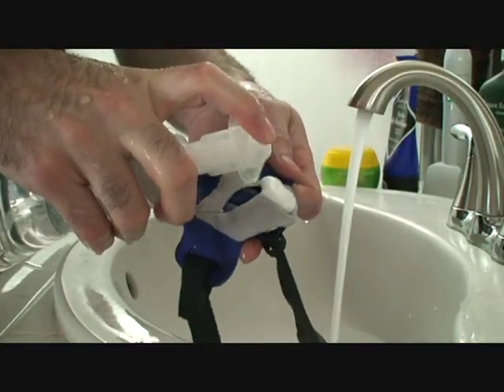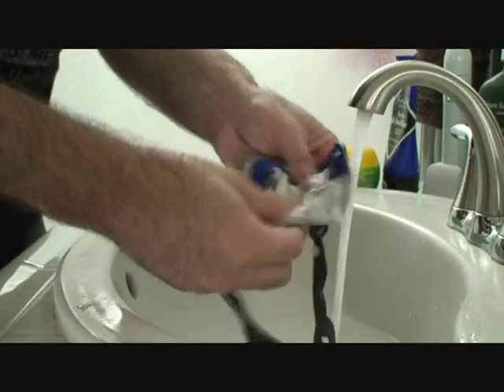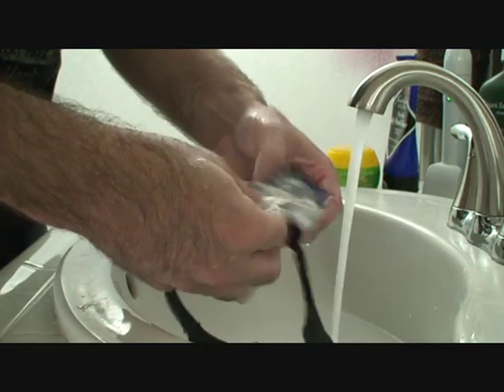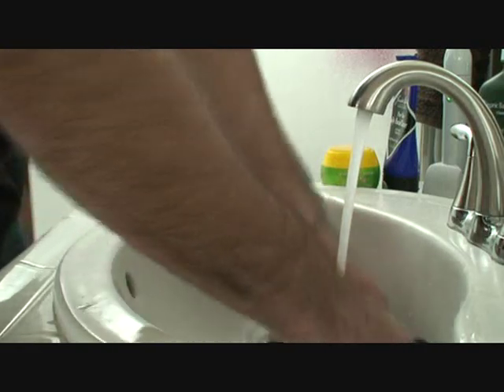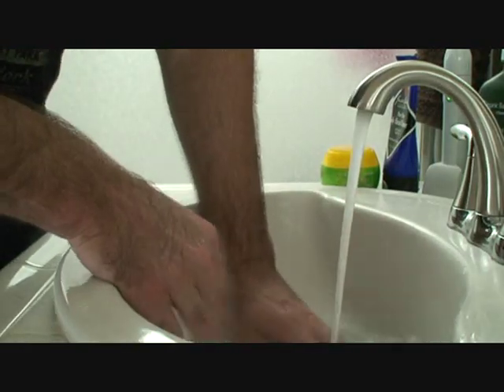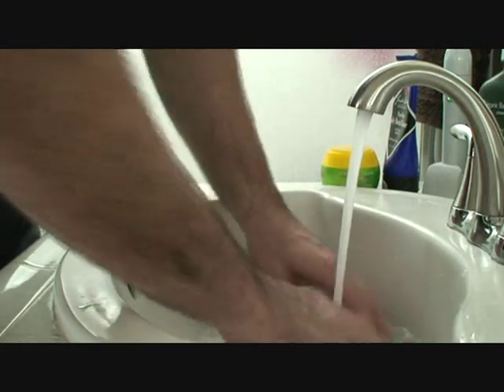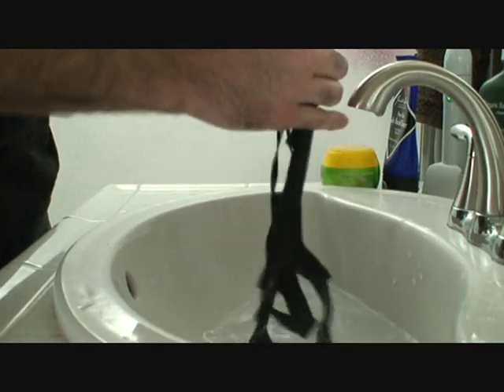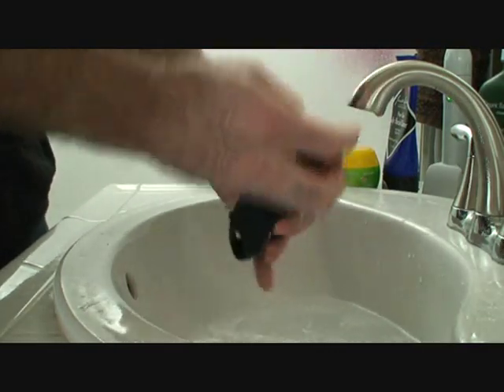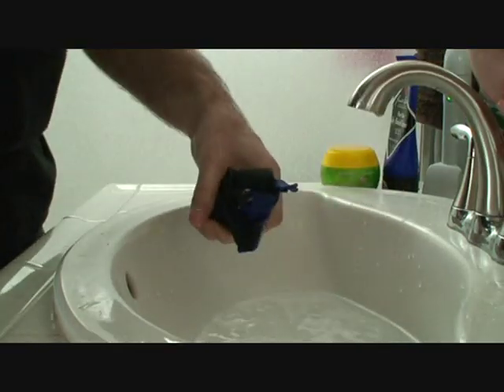Got it. All right, now while I had tons of riveting footage of me washing a mask, this is just one time. I would wash it twice a day for a month, and I found that washing it in the sink was by far the best way. One of the other ways they say you can wash it is in a washing machine on a delicate cycle. I did that with another mask, and it didn't destroy it by any stretch, but it just seemed like this was a much more gentle and effective way of cleaning it. Just my 2 cents. No more of this, I promise.